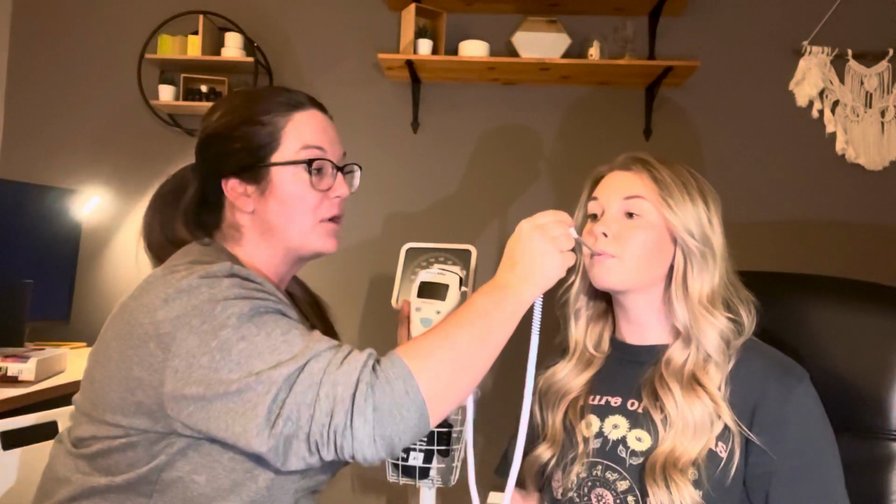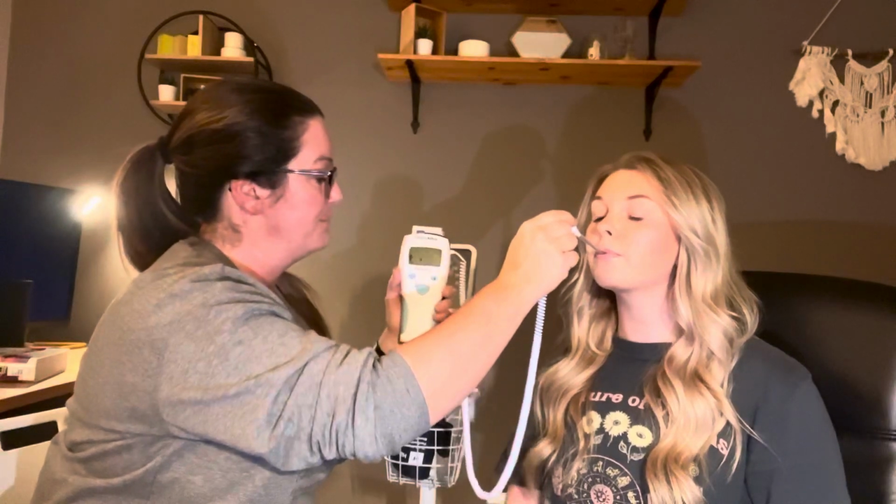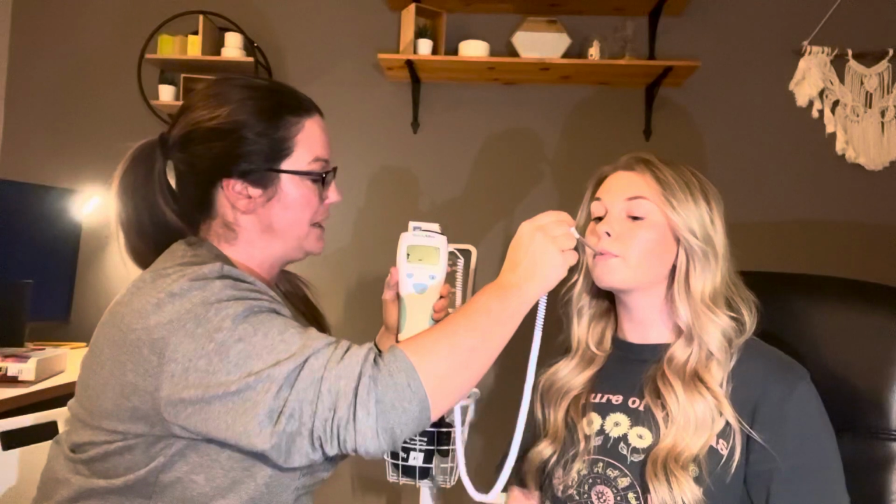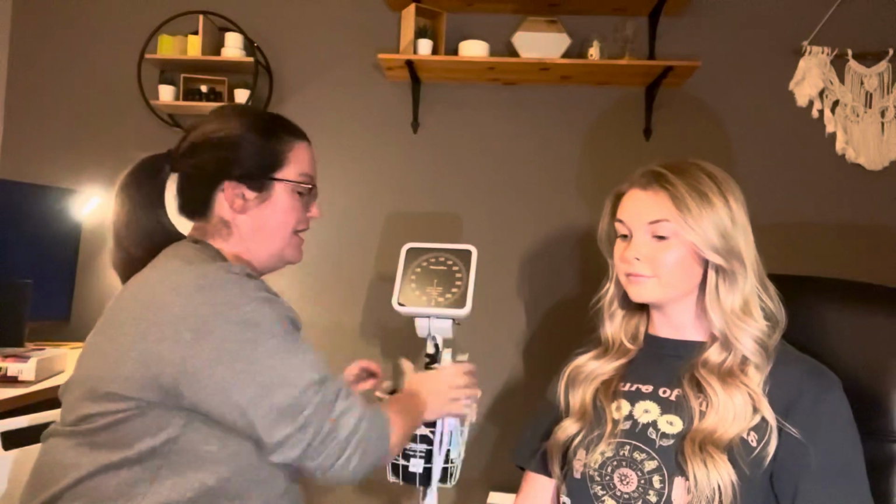So I placed the probe in the posterior sublingual pocket. When it starts to spin, that means it's reading, and I'm just gonna wait for it to beep. So 37.3 degrees Celsius. So the normal parameters for a temperature is 36 to 38 degrees Celsius. When I press this button, it's gonna release the probe cover into the garbage, place this back in and the machine shuts off.